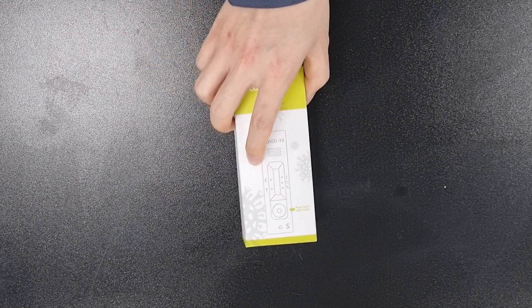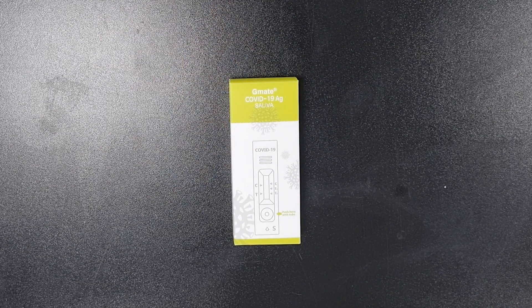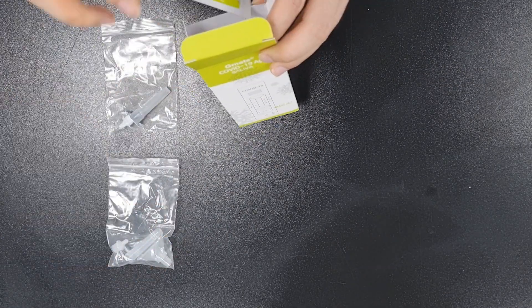Step 1: Leave the kit at room temperature to match the reagent's temperature. Step 2: After 30 minutes, open the kit box and place all components on a flat and clean surface.